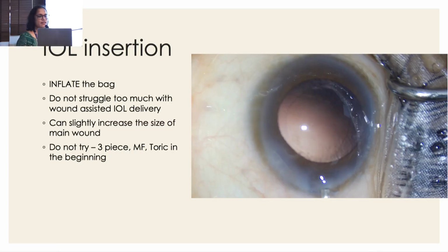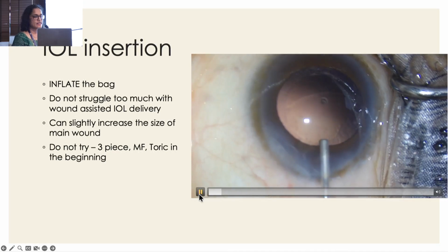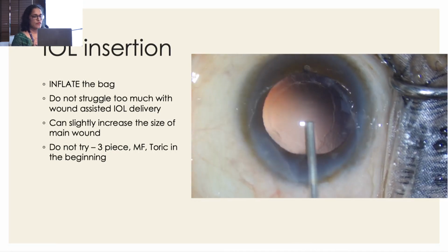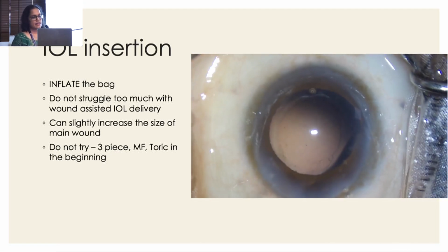And also IOL insertion: always inflate the bag. Coming to the foldable IOLs, always inflate the bag. You can see with the visco, the bag is getting inflated. Always go to the center, inflate the bag, and then insert the IOL.